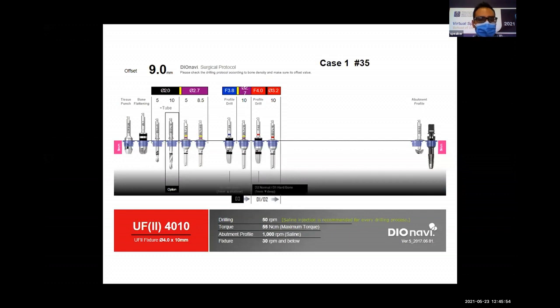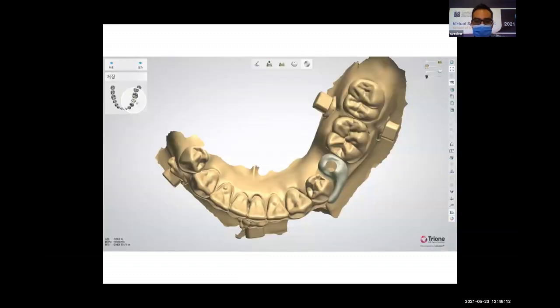Sometimes the surgical protocol could be delivered at the demand of the surgeon. It is usually not needed for the surgical process, but if the practitioner asks, it could be delivered. Another material that could be produced for us is a transferring jig, which helps us transfer the abutment to the mouth in the proper direction and rotation.